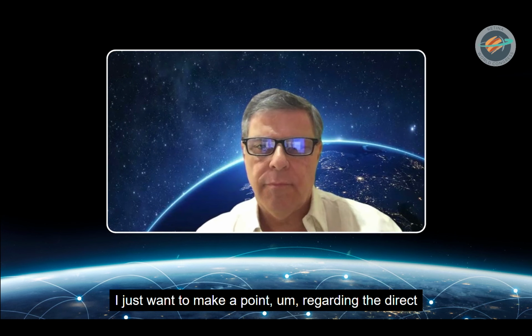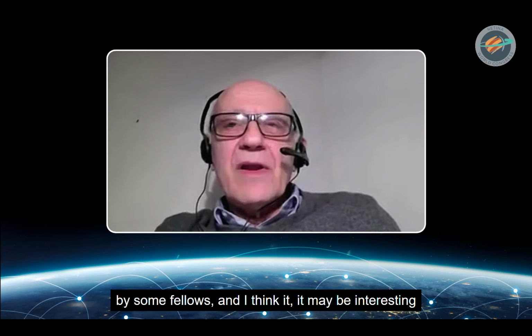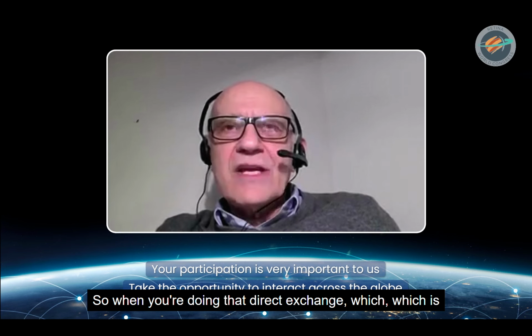Paulo? I just want to make a point regarding the direct exchange of silicone oil and perfluorocarbon, simply because this question has been asked of me by some fellows, and I think it may be interesting for everybody listening. When you're doing that direct exchange, which is what I prefer, incidentally, I don't go through air because I don't like the idea of possible retina slippage.